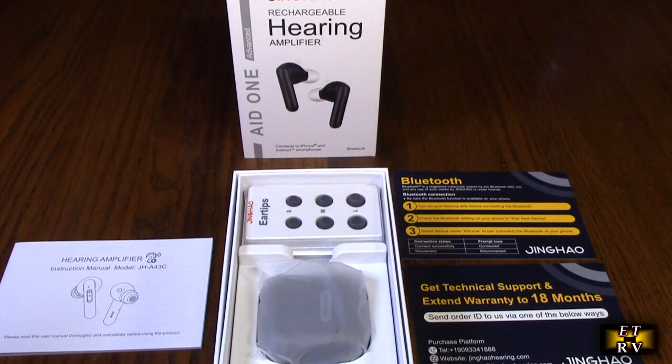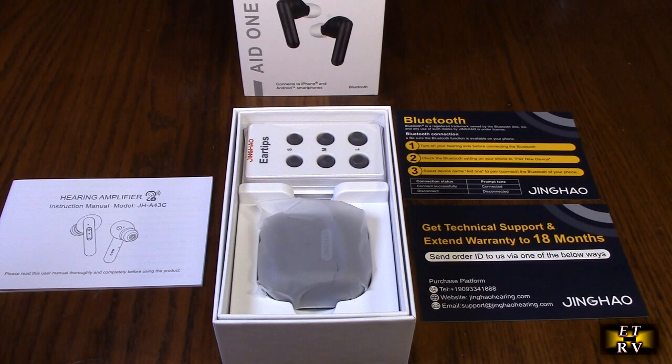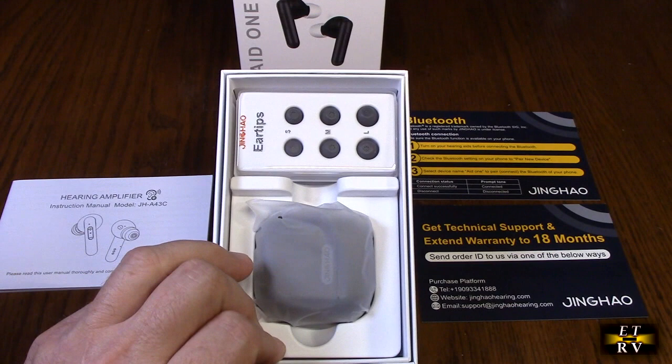Hello again, this is Robert Veach here. This is my video review of the Jing Hyo brand Bluetooth hearing aids for seniors — the rechargeable, built-in digital chips with noise cancelling and power display. This is the black color and it comes with an instruction manual.